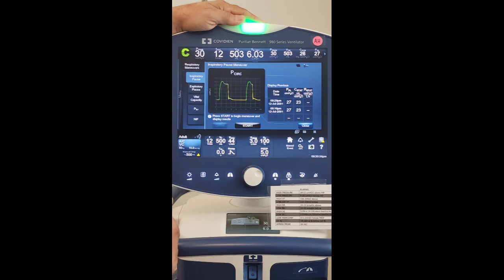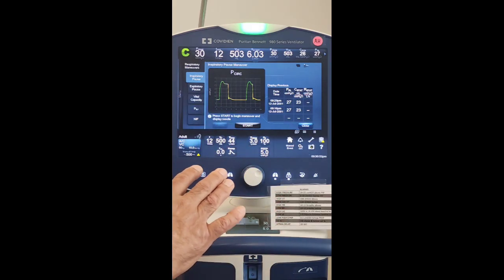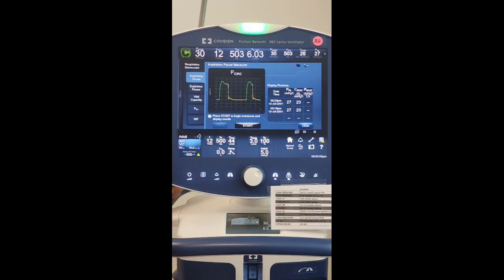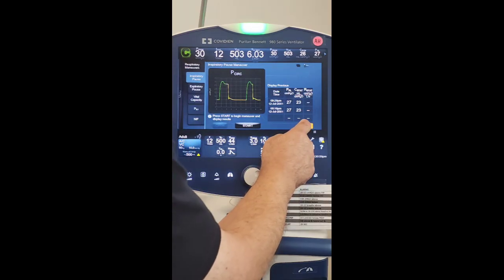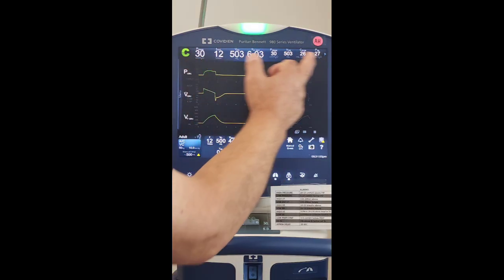But since we do not have a normal patient here, what we're going to do is set this patient up on a pressure control. We're going to start out at 10 to 15. I'm going to go with 15 pressure control. But before we switch him over, let me close this screen. I want you to do that vent check, write down these numbers.